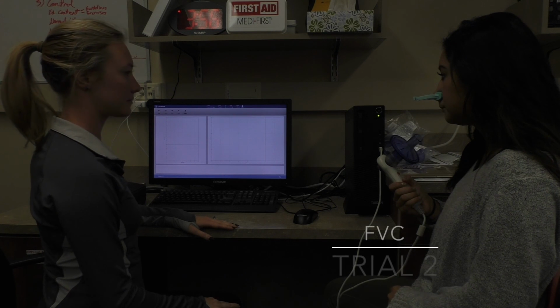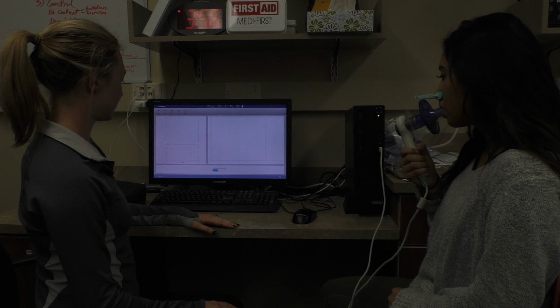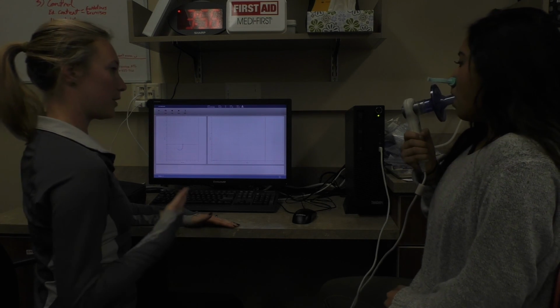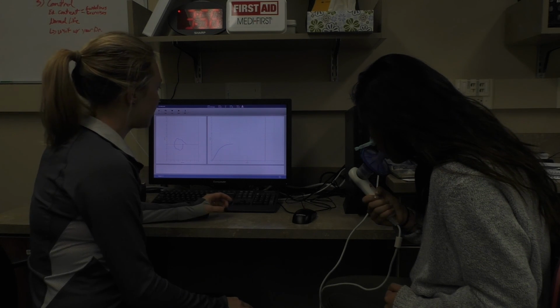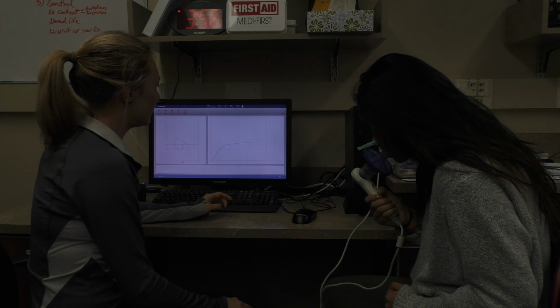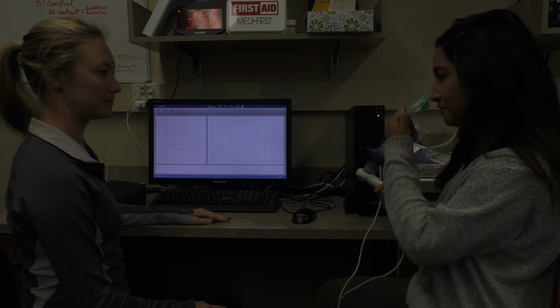This will be FVC trial 2. Go. Breathe in. Okay, faster, faster. Keep going. Keep breathing. Good. Good job.